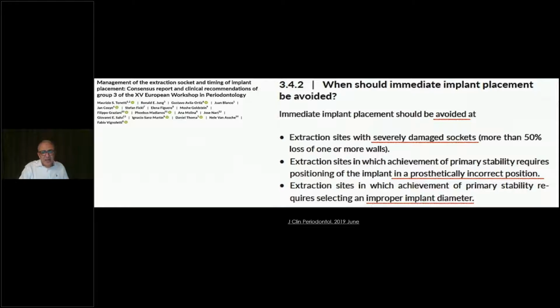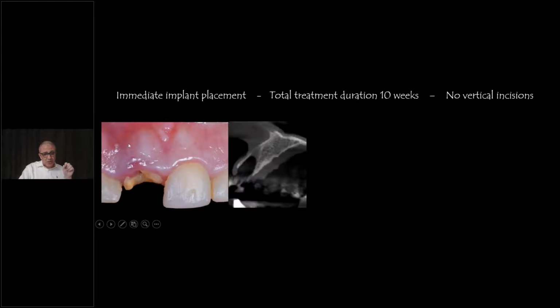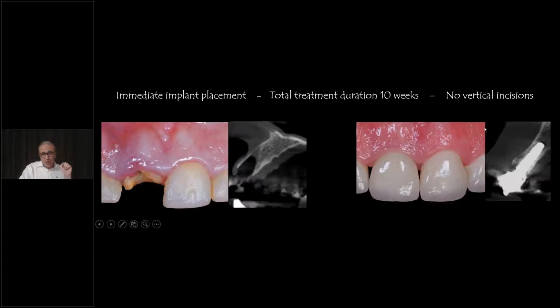But I think I will enlighten you with some new work that I conducted with a group of coworkers 2 years ago. I started a new technique that enabled me to treat and move this type of situation into this type of situation with no vertical incisions, with flapless placement, immediately, over a 10-week duration.